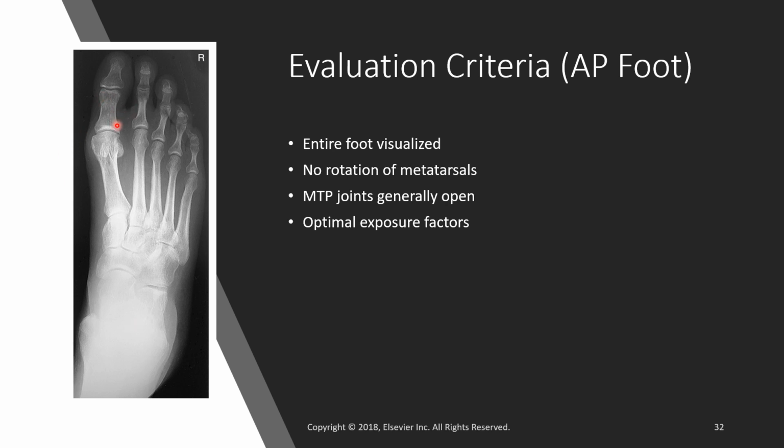If you are perpendicular to the metatarsals, then your metatarsal phalangeal joints should be open. All right, and this, like I said, this is figure 6.57 on 232, and this is actually a really nice image of the AP foot.